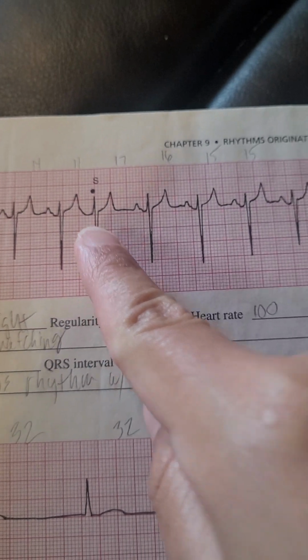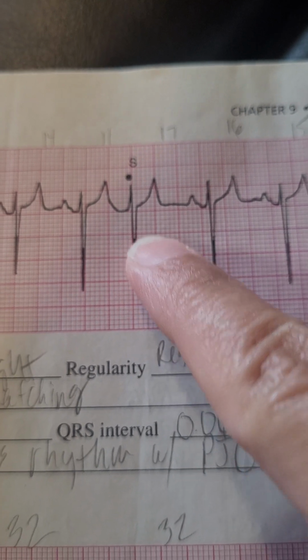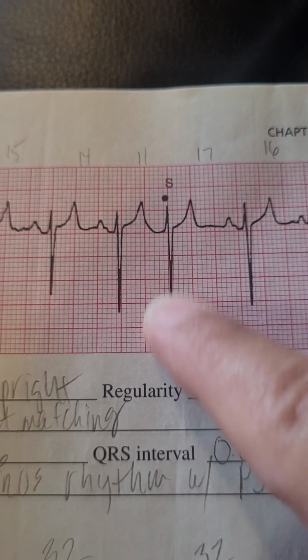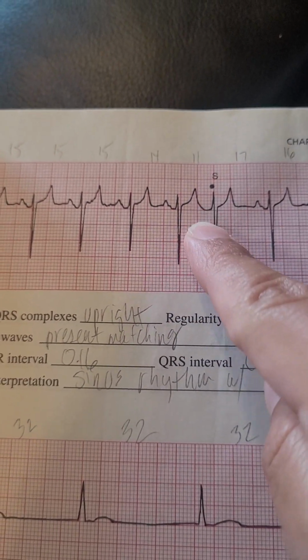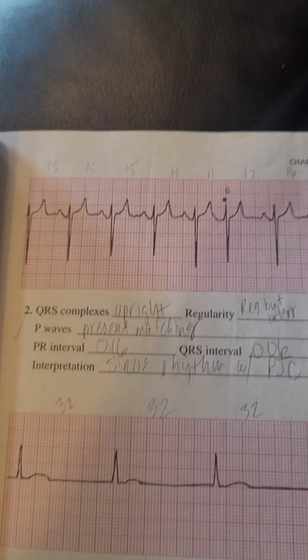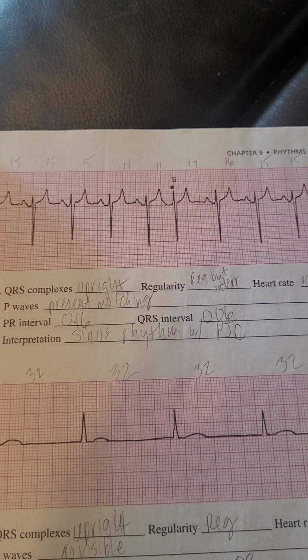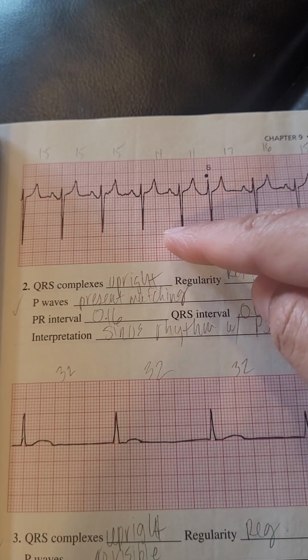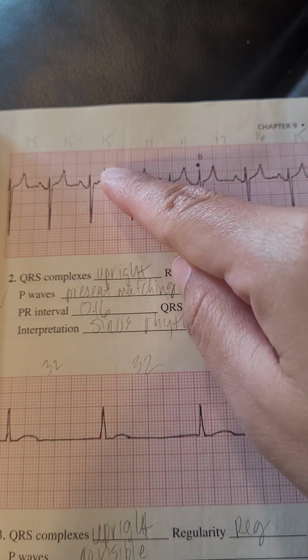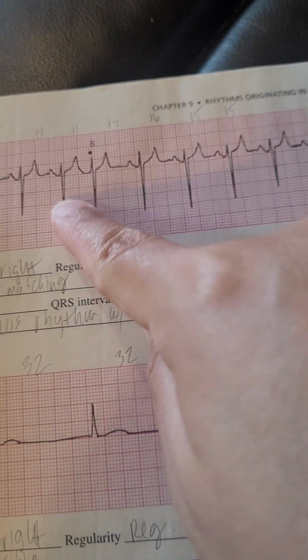They're all marching out. You get one premature beat here, but you don't know if it's PAC, PJC, or PVC. But how would you know? Because there's no what? P waves. So everything else is marching out, right? Except this premature beat. You have to pay close attention because you've got so many different rhythms. You got to make sure that you see the P waves, that you see the QRS, that they're all marching out within around the same amount of squares between them, and that you see a premature beat.